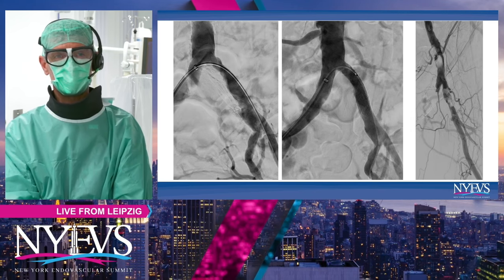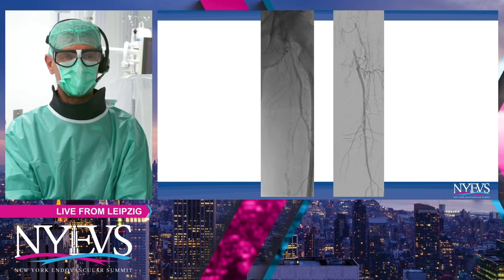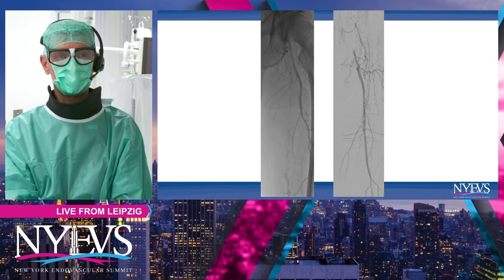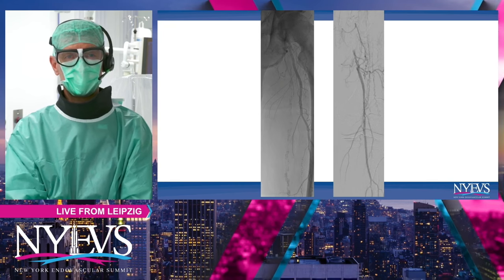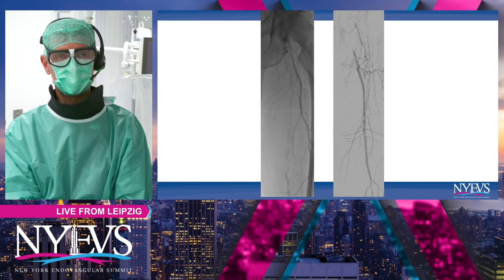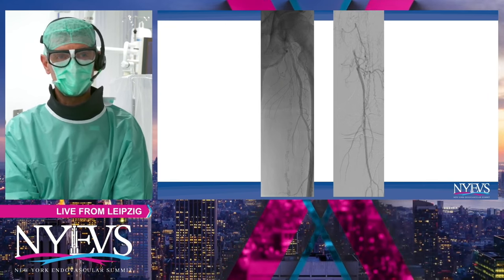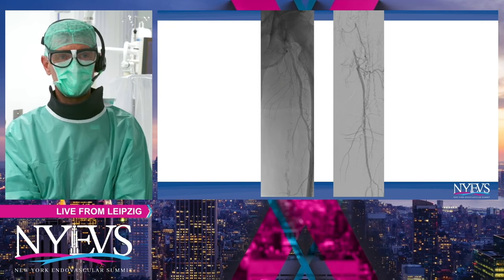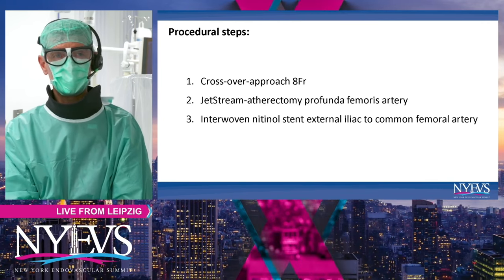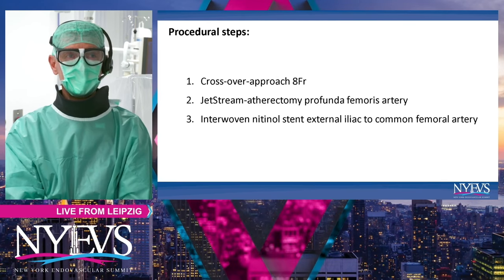Next shows you our intended stretch. This is the outflow, and then again a long SFA total occlusion, very calcified. We thought first to treat the common femoral and profunda, and I think this will help him a lot. Then we can decide whether we continue to treat, but I don't think it's primarily necessary to open up the SFA. Next, please, shows you our intended strategy: go crossover, 8 French.